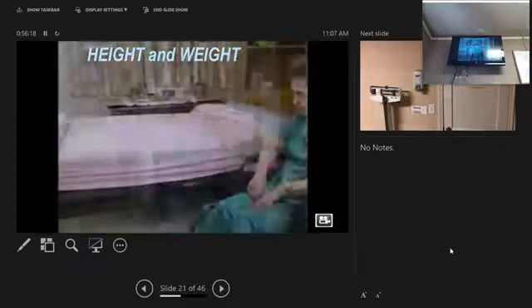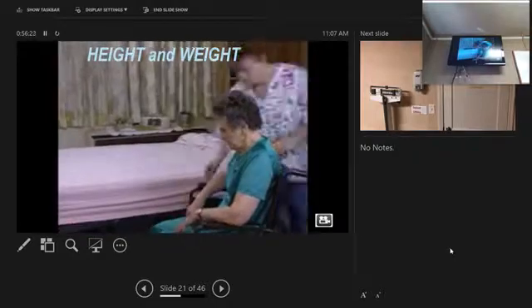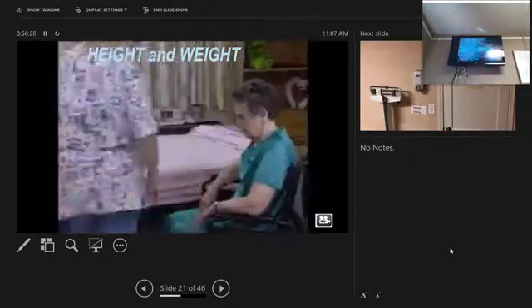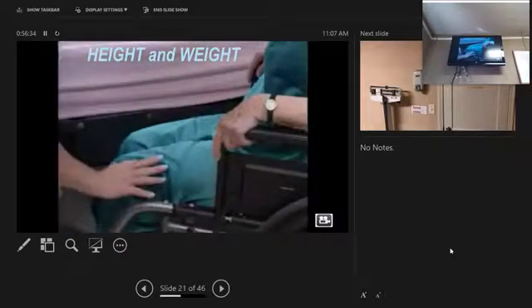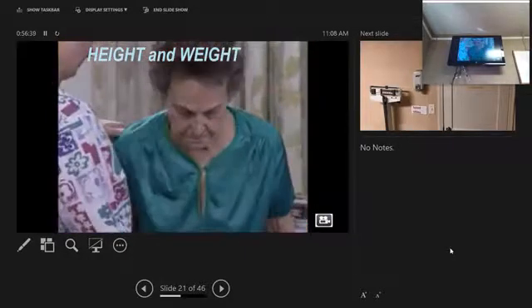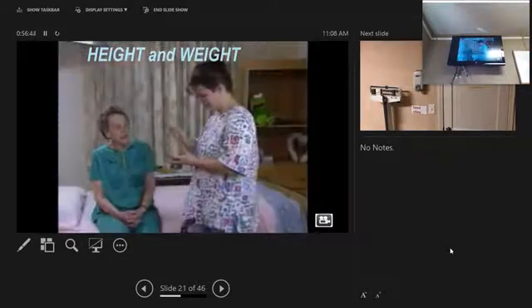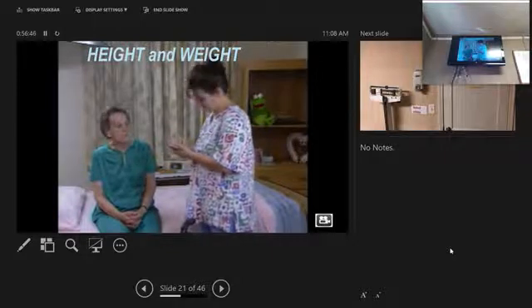Return the resident to his or her room and assist the resident in transferring out of the wheelchair. Begin by locking the brake and lowering the footrests. Lower one footrest and help the resident to place his or her foot on the floor. Repeat for the second footrest. Assist resident out of the wheelchair. Subtract the weight of the empty wheelchair from the weight of the resident in the wheelchair and record this number. This is the resident's weight.